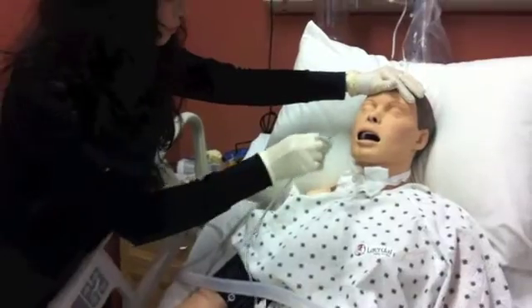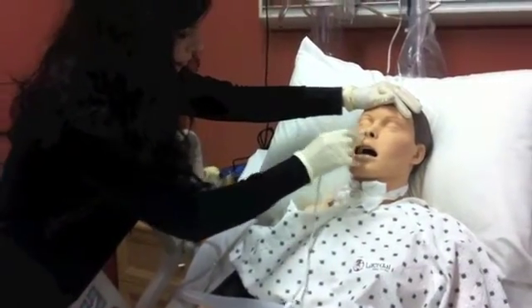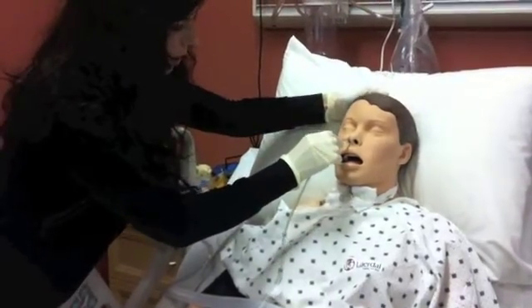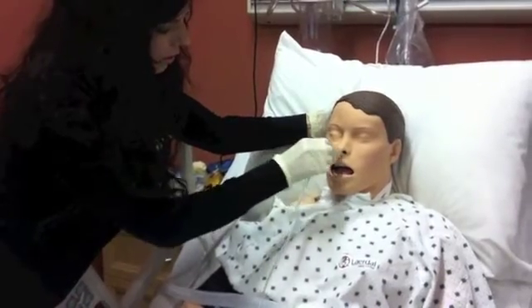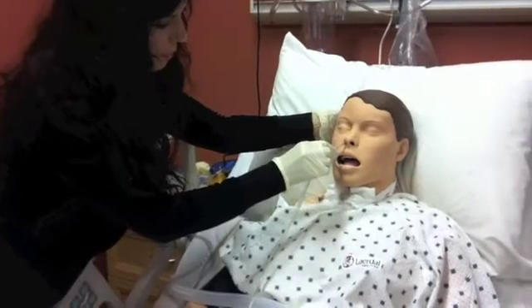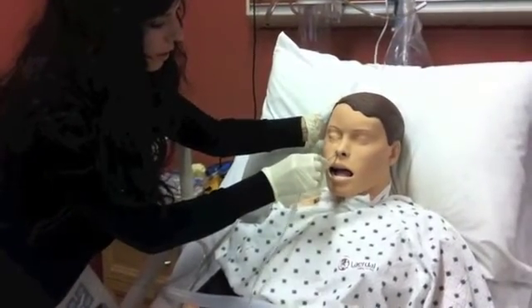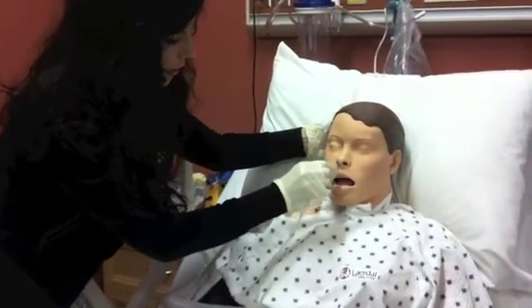Help the patient push their head back into the pillow and insert your tube into the nares. Insert until you reach a point of resistance, then tip the head forward and insert the tube farther down while instructing the patient to swallow. Offer a sip of water and continue until you can't go any farther.